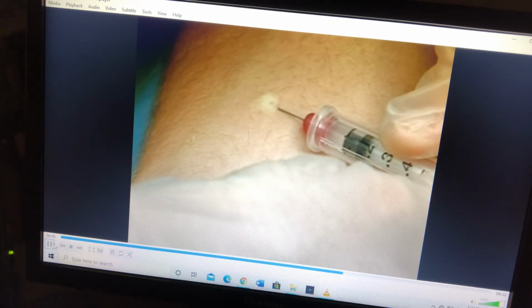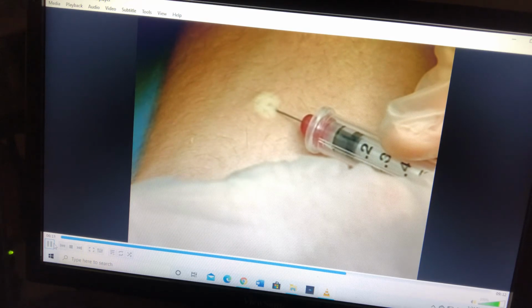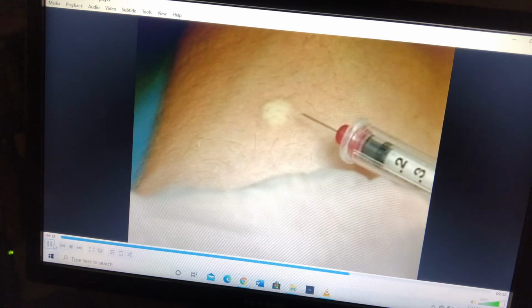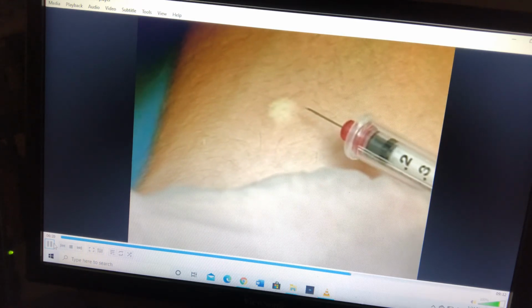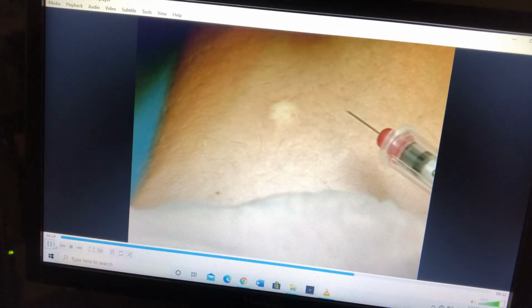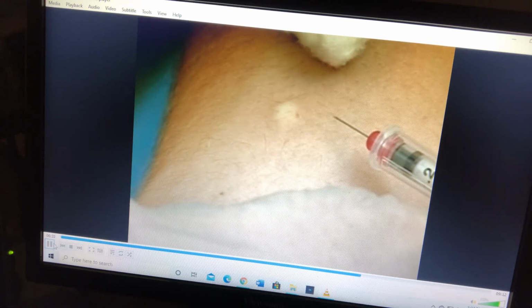Watch for a wheal to appear on the surface of the skin. This indicates that the correct injection technique was used. Withdraw the needle quickly and smoothly at the same angle that it was inserted. Blot gently with a cotton ball if necessary. Do not massage the site. Massaging can disperse the agent into underlying tissue layers or out through the injection site.